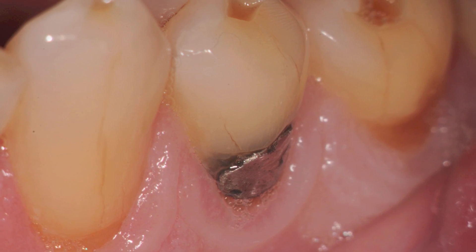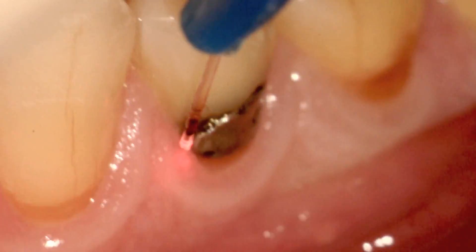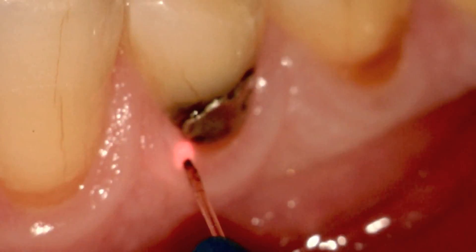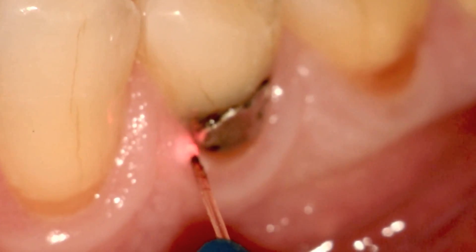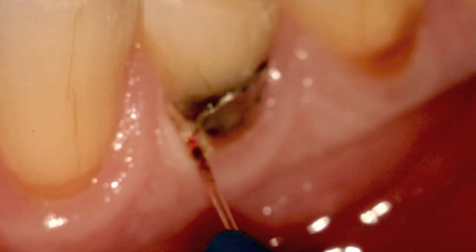When we get to the video, you'll see me have an initiated tip, and I tend to wait on the tissue, just waiting until I see a plume of smoke to know that it's ready to go. Leave it stationary — you can see right there there's a plume of smoke, and you know you're good to go.